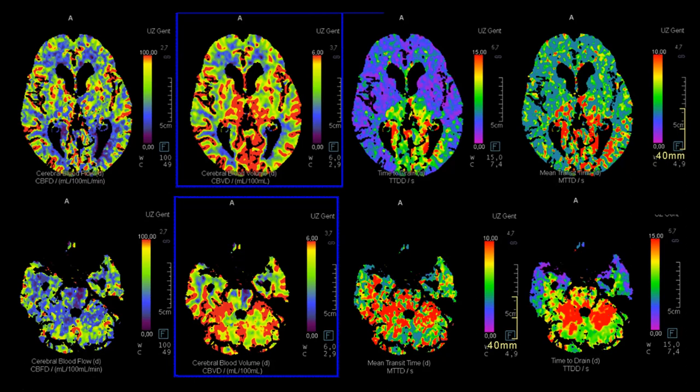Perfusion CT definitely has a role in increasing your diagnostic accuracy, but it doesn't really play a role in treatment selection or the decision to treat yes or no. To be even more frank, there is very little evidence that thrombectomy in a large vessel occlusion in the posterior circulation is an effective or beneficial procedure, but in a lot of centers they will do it nevertheless, because these occlusions have such a bad morbidity and mortality rate that, doing nothing, the patient has a very high risk of dying or having severe neurological deficits, so you can only give your patient a chance by doing the procedure. But the evidence is quite low.